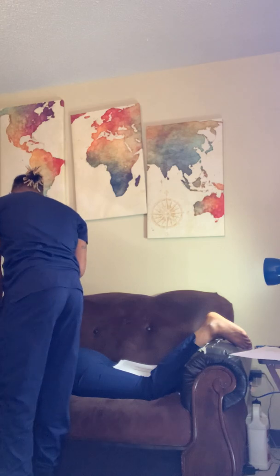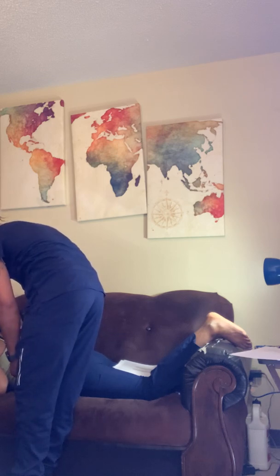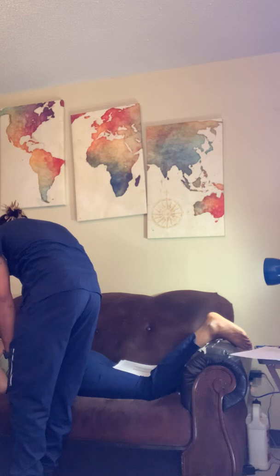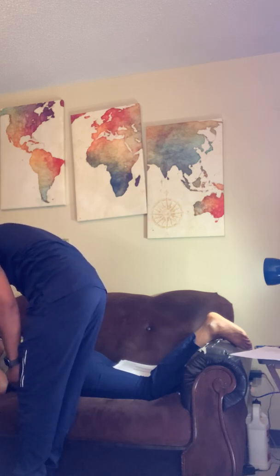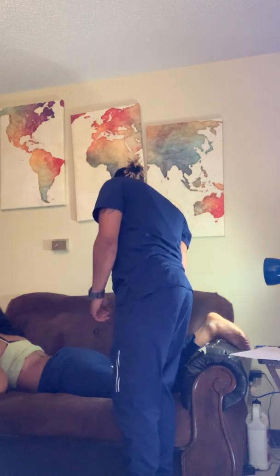in all 9 lung fields. 1, take a deep breath. 2, take a deep breath. 3, take a deep breath. 4, take a deep breath. 5, take a deep breath. 6, take a deep breath. 7, take a deep breath. 8, take a deep breath. And 9, one more. All right, good deal. Lung sounds are clear bilaterally.